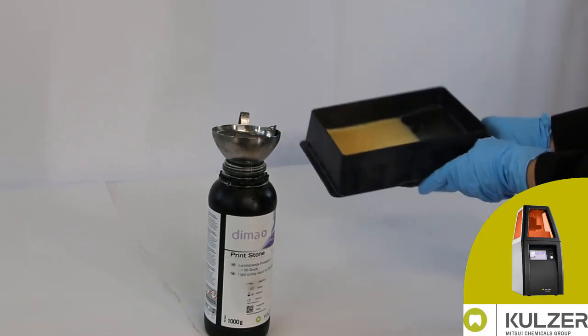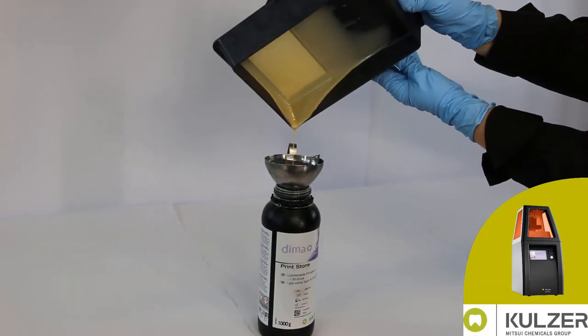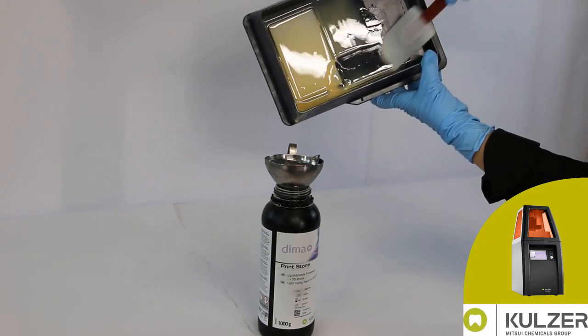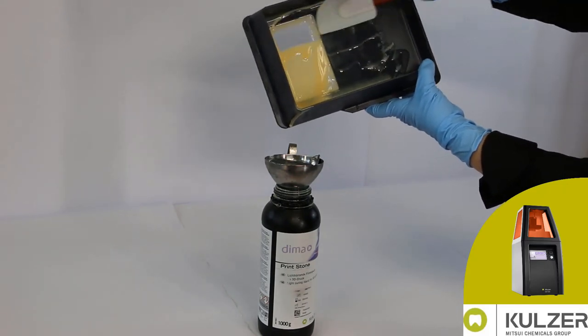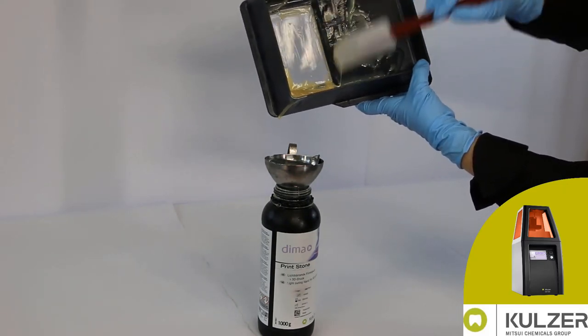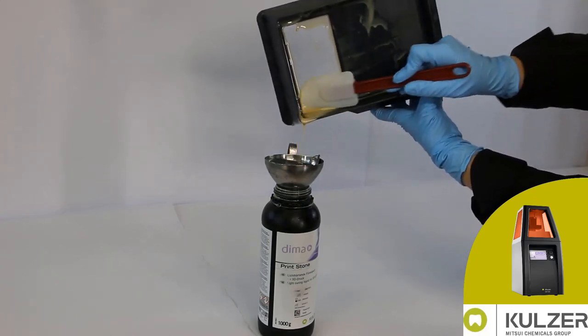Pour the remaining material over one edge of the tray into the steel funnel with the attached strainer. Use the silicone vat spatula included in the accessory kit to push material residues together and fill them into the bottle.